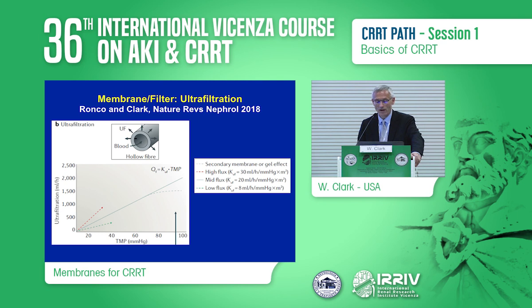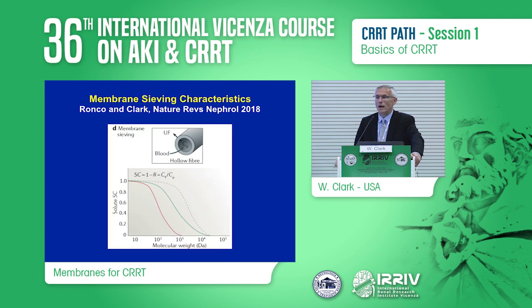Again, as we'll talk about, you see this bending of the curve, if you will, that represents secondary membrane formation. Dr. Ronco referred to this as concentration polarization, but essentially it's an additional resistance to both fluid and solute transport. And again, we'll talk about that extensively as we go on here.